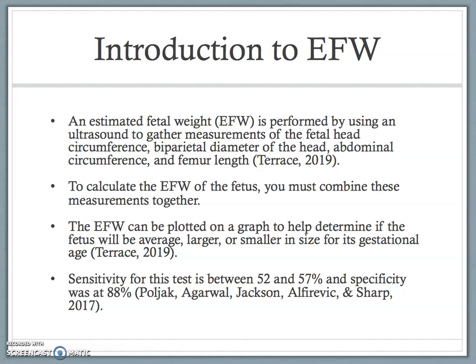Surveillance of fetal growth is essential for good prenatal care. It can decrease the chances of a stillbirth or other complications. The sensitivity for this test is between 52 and 57%, and specificity was at 88%.